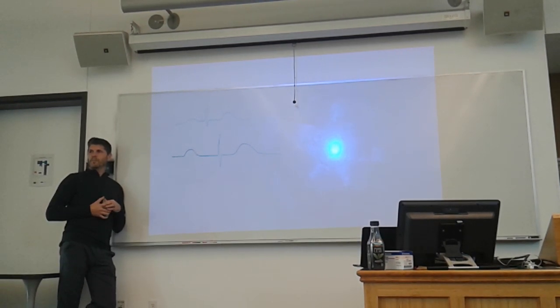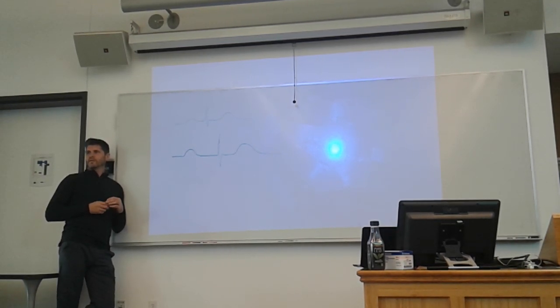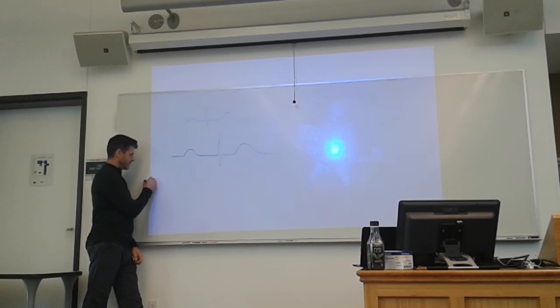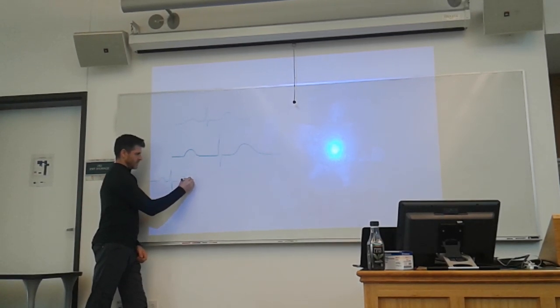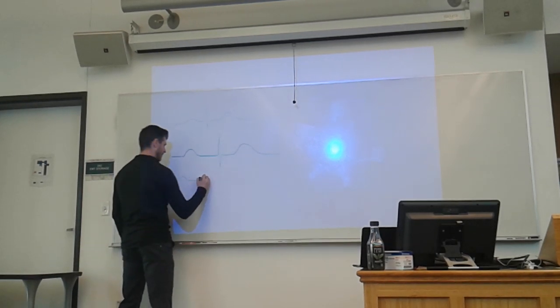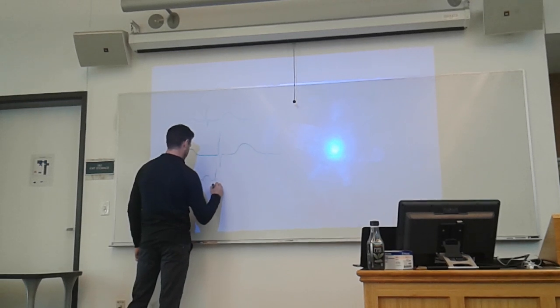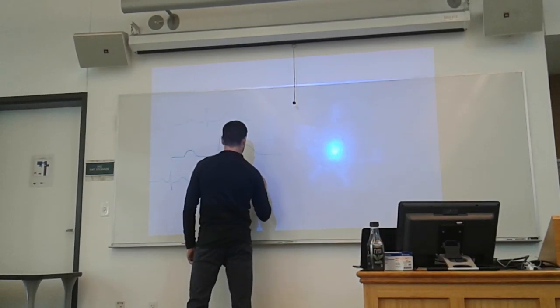Give me more information about that P wave. The last couple of P waves you just talked about. They will still be in time with each other. The P wave morphology will be normal. So is this what you're really saying?